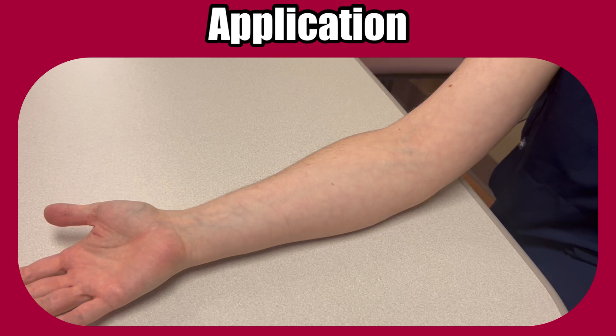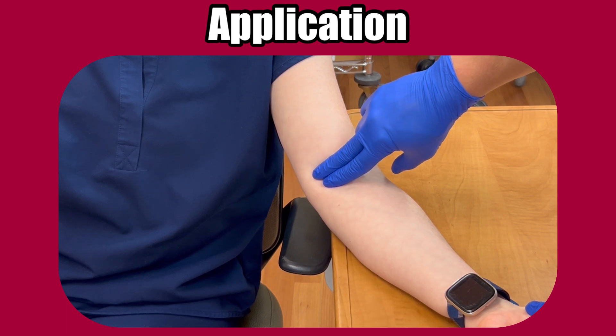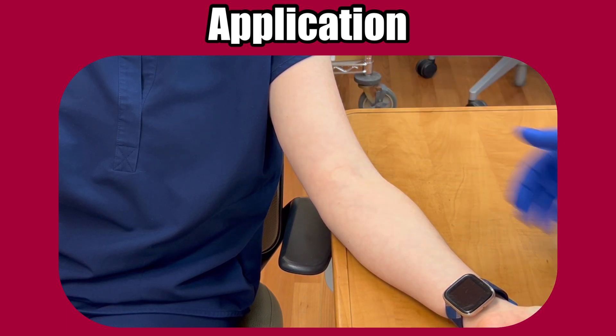Have the patient bend their elbow slightly. The brachial artery is just above the bend of the elbow, on the side of the bicep muscle. Feel for the pulse with two fingers lightly pressed on the patient's skin. Move your fingers in this area until you feel the rhythmic thumping of the pulse. If you want, and if the patient agrees, you can mark the site with a body marking pen. This can be helpful because you're going to need to line that artery indicator up with this location.